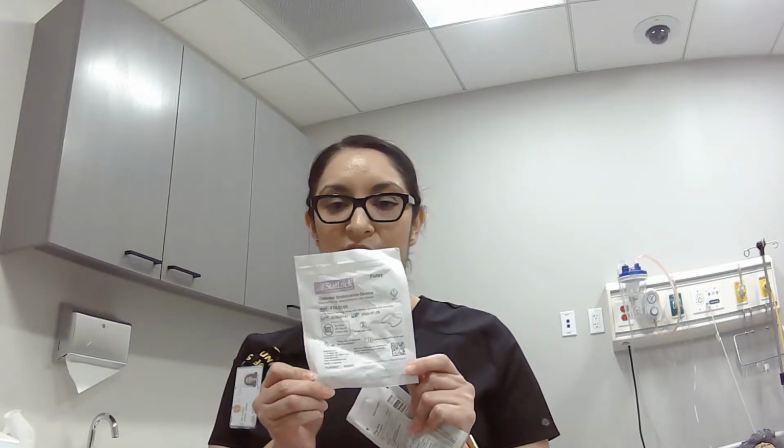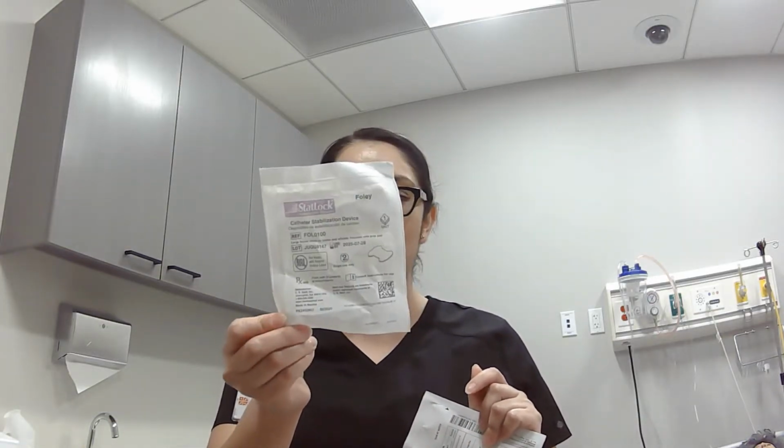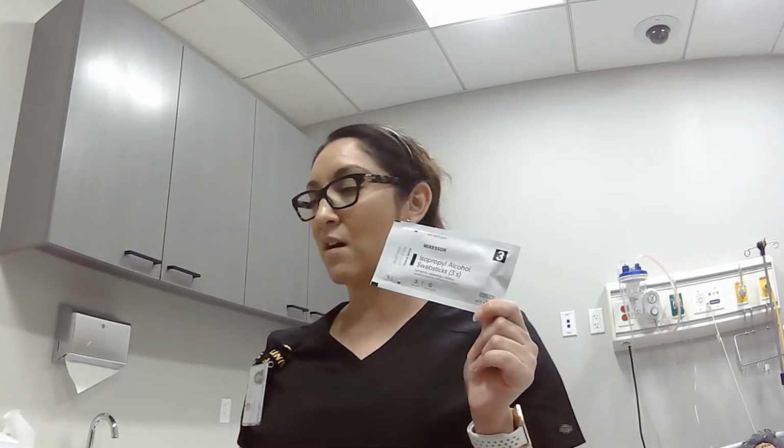And then I'm also going to get the stat lock. So the stat lock looks different depending on which facility you're at, what supplies they get. It's going to vary, but the one that we have here is the stat lock, and that will be placed on the thigh after the Foley catheter is inserted, so it is stabilized and it doesn't move all over the place.